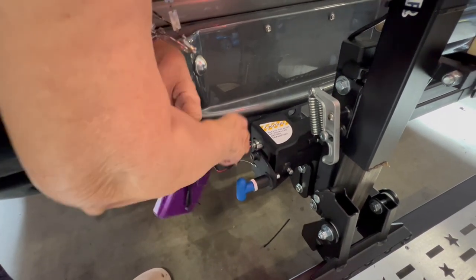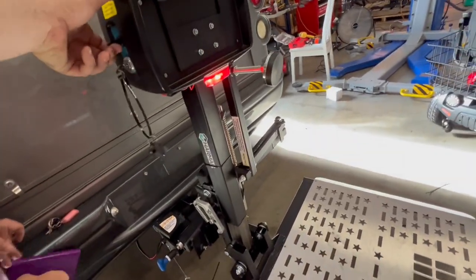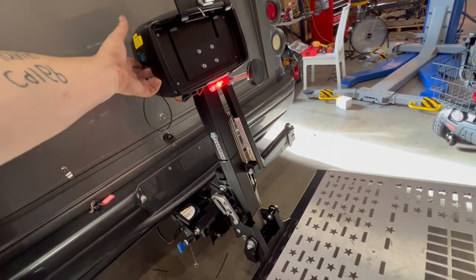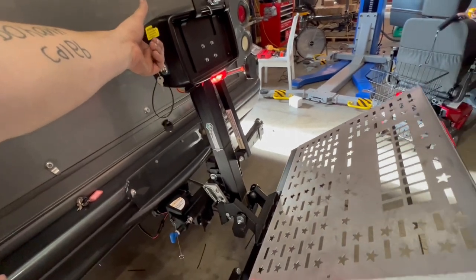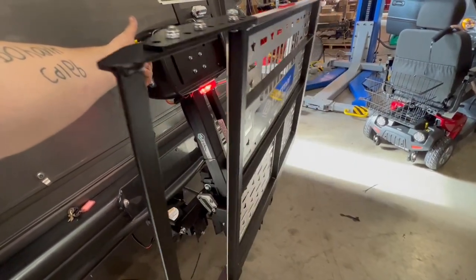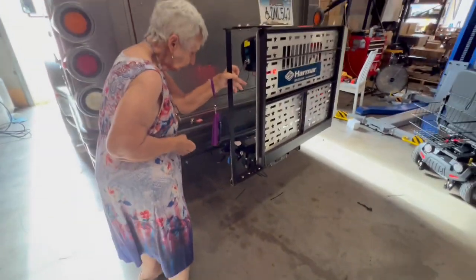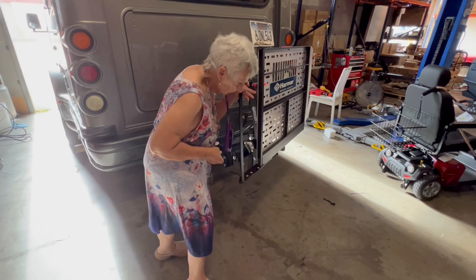So you pull the pin. Watch your leg. Then all I have to do is lock it over.